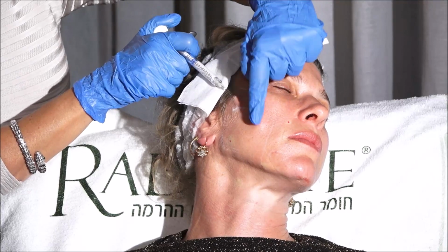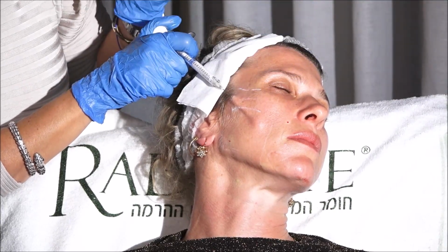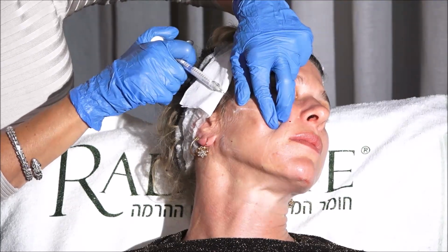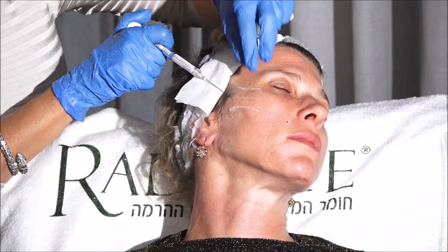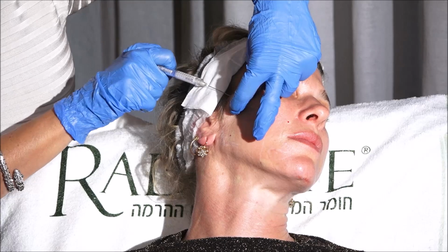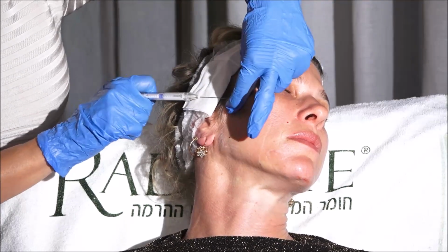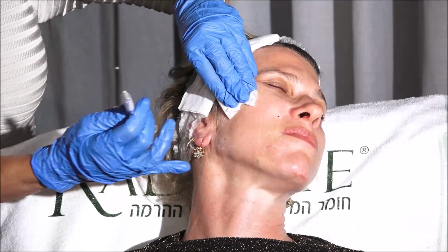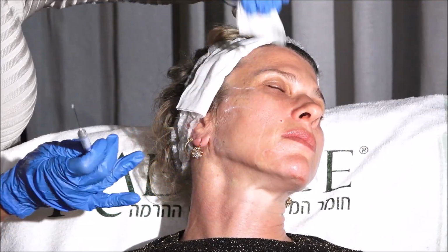Here, for example, I'm too deep. Can you see the difference? Okay, go back and try to break through that. Normally, I use half, so 0.75 up, 0.75 down.